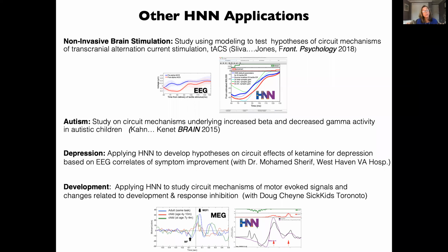But the signals do look the same. Beta events that we measure on EEG sensors look just like beta events that we measure in source localized signal. But with the source space, we have directionality. We know which ones are going out of the cortex and which are going into the cortex. At the sensor level, you have to infer that information. I see. Okay, thank you.